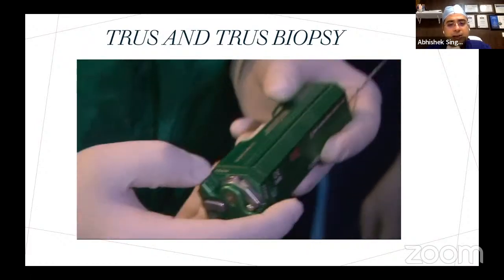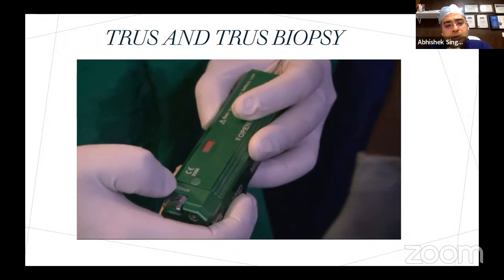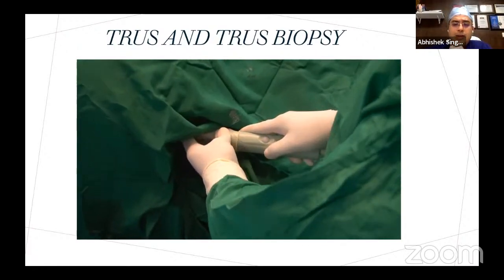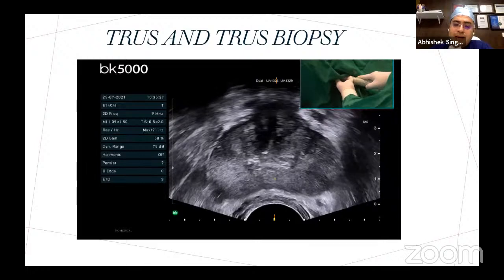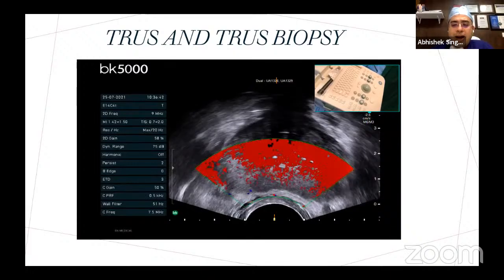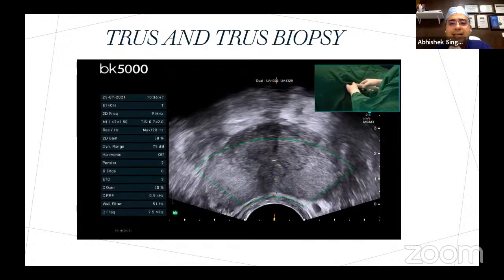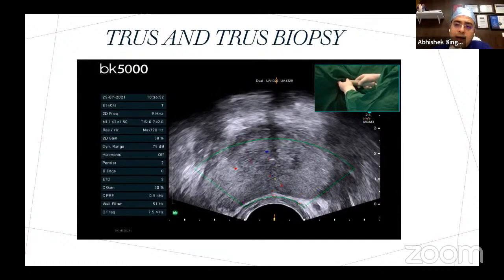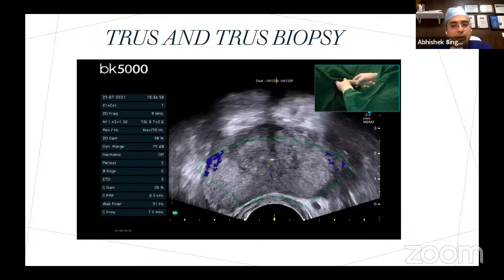You can see that you have two core lengths, 15 mm and 22 mm. For a TRUS biopsy, you should choose a 22 mm core length. Now the TRUS probe is introduced while the convex surface of the probe is towards the prostate. Once you lever your hand down, that means the tip of the probe will go up and you will visualize the right side of the patient because the patient is in left lateral position. Similarly, if you lever the probe up, the tip will go down and you will visualize the left side of the patient.